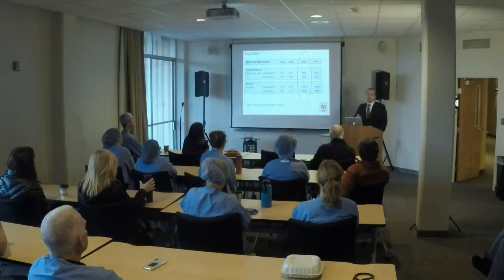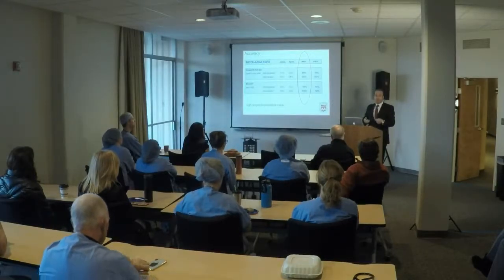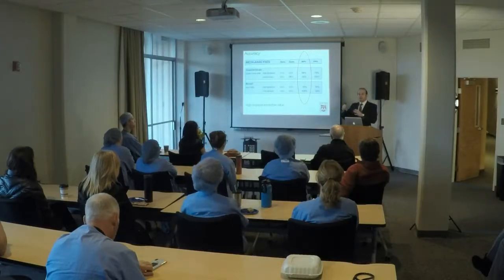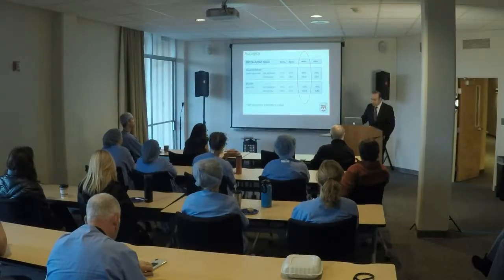And what I mean by that is patients aren't having events for at least 7, 8 years, and I suspect that to reach a decade after a negative coronary CT angiogram, which has great prognostic implications compared to bread and butter functional stress testing, where we tend to see an uptick in events after 18, 20 months after a negative functional stress test. So that's really important.